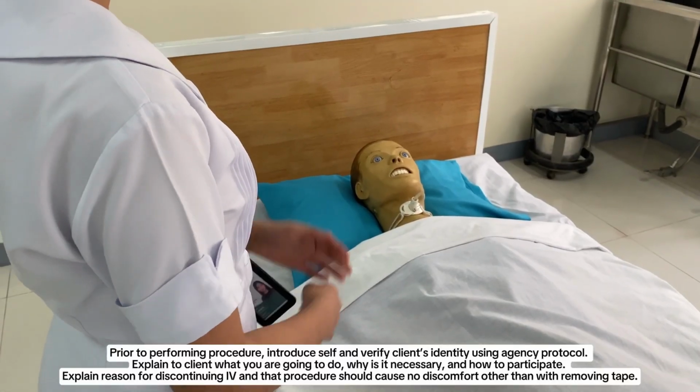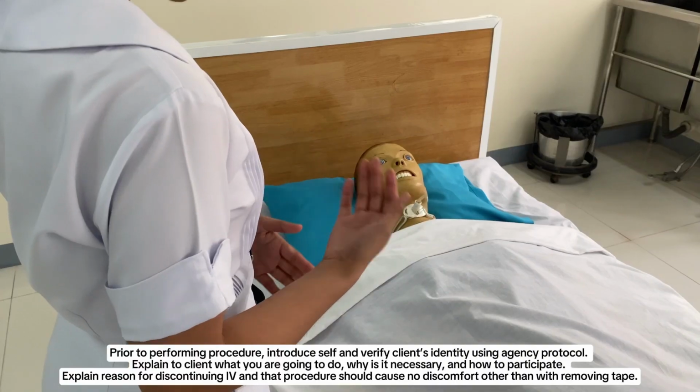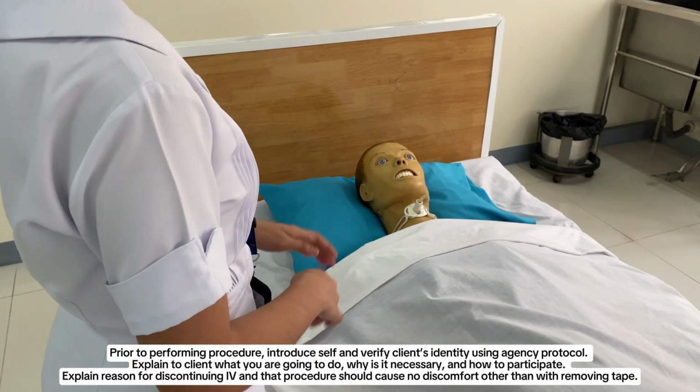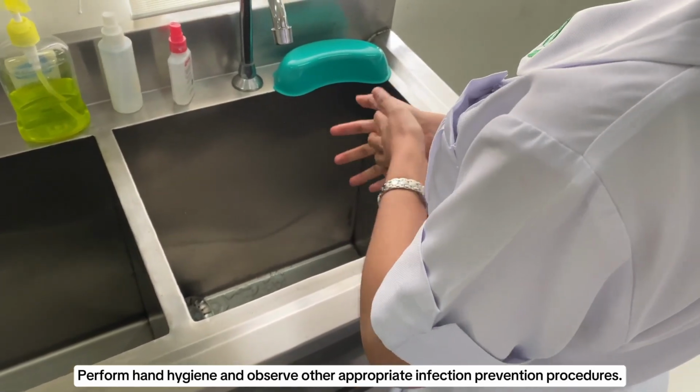Prior to performing the procedure, introduce yourself and verify the client's identity. Explain to client what you are going to do, why it is necessary, and how to participate. Perform hand hygiene and observe infection prevention procedures.